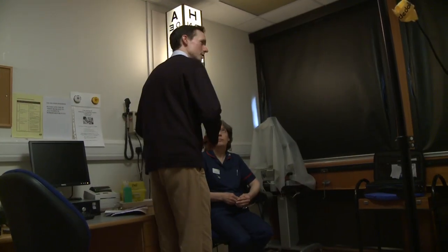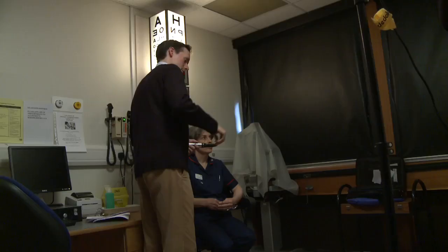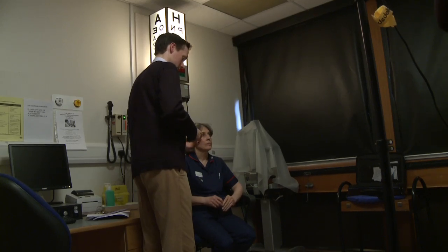You should use a darkened room and ask the patient to stare at a distance target, ideally just above head level. If a patient is significantly short or long sighted, with thick spectacles, it is sometimes easier to perform ophthalmoscopy through their glasses.